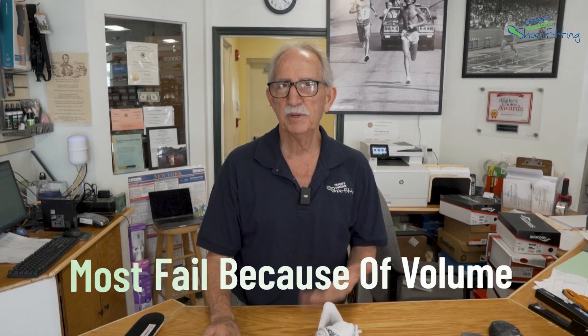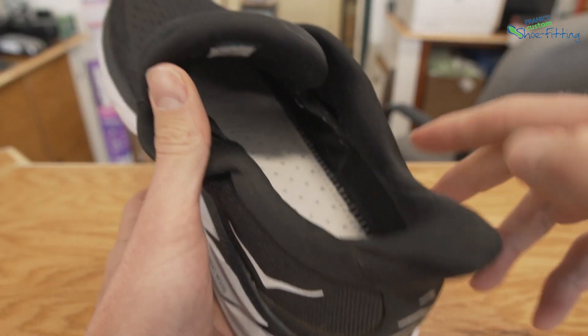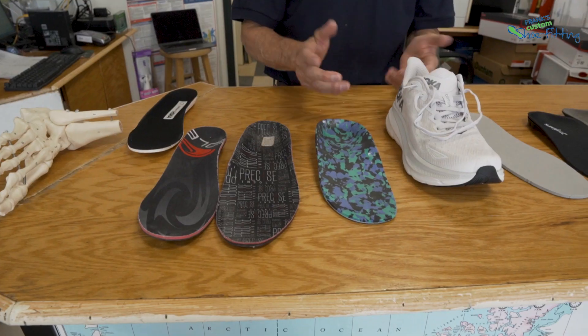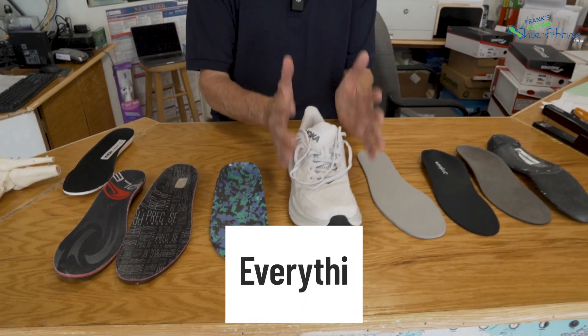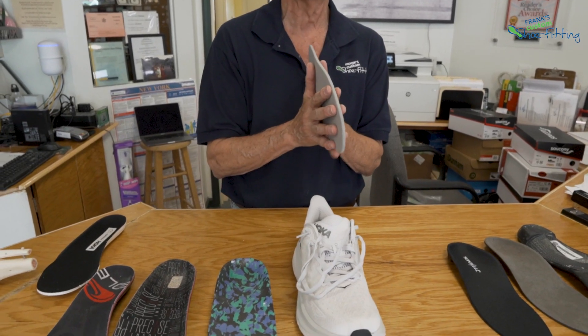Most fail because of volume. Volume means they're too thick, they're too bulky, they take up too much room in the shoe, forcing you to wear a shoe that is not a better fit to begin with. For me, everything is about the fit of the shoe. When something comes out of the average fit of a shoe, you want it to be no thicker than what came out of the shoe, which is usually about an eighth of an inch, give or take.